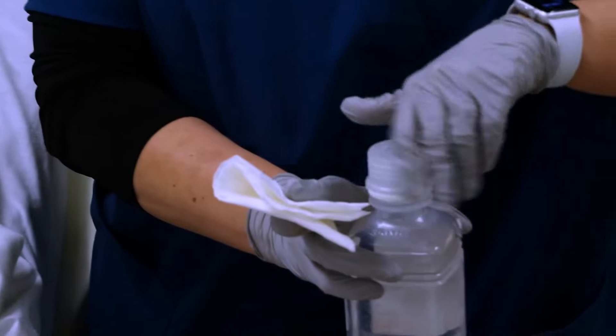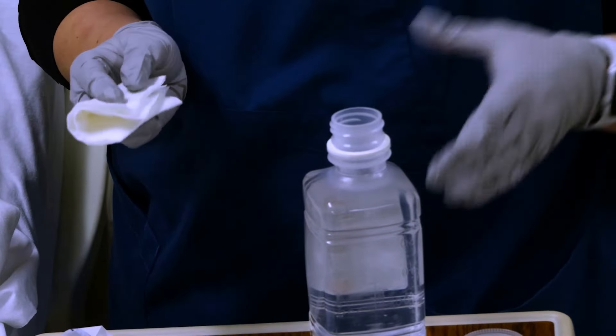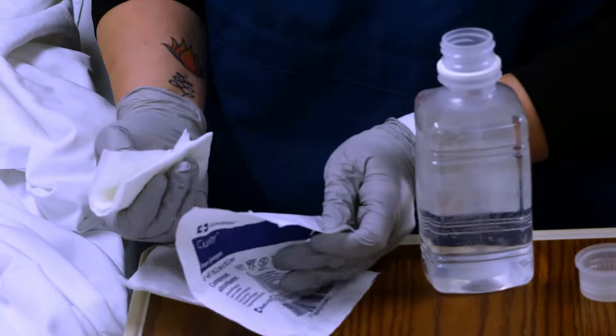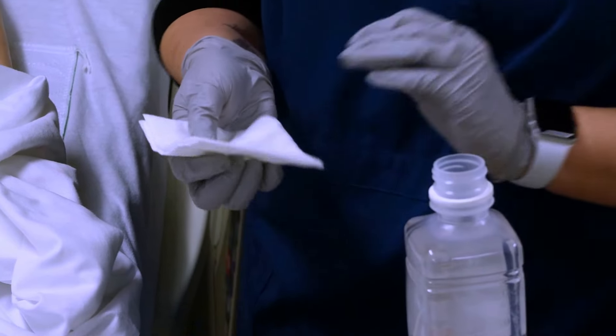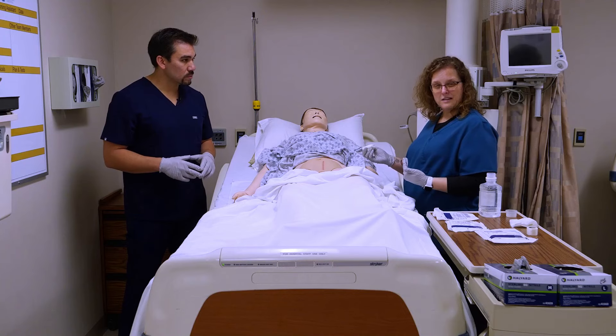This is not a sterile dressing. I don't want to contaminate the inside of the cap, and I don't really want to contaminate this. These are actually pretty impermeable, so you could use that as a surface, but I don't need that much. Her incision looks great, so I'm just going to pour out a little, and then I'm going to be careful about how I clean this.